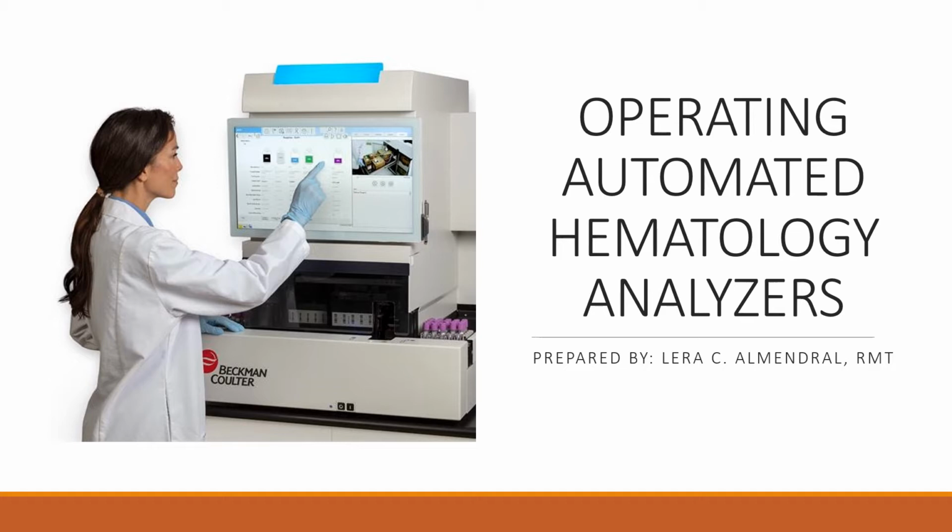These analyzers typically provide the 8 standard hematology parameters that are seen in your complete blood count, plus a 3-part or 5-part differential leukocyte counting that can be performed in less than a minute using 200 microliters of whole blood. The good thing about automation is that it allows more efficient workload management and more timely diagnosis and treatment of disease, which is actually the target of the laboratory procedures performed inside the hematology section.